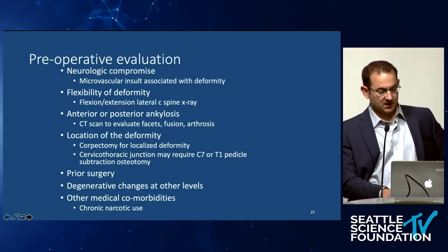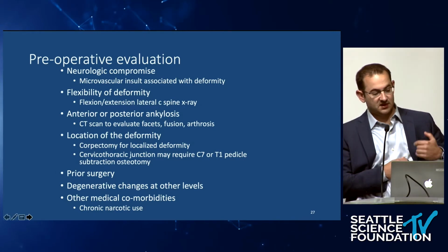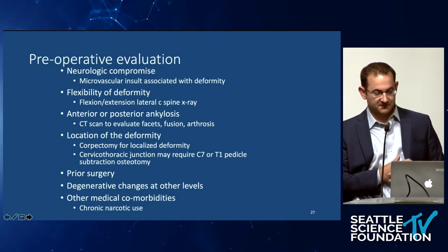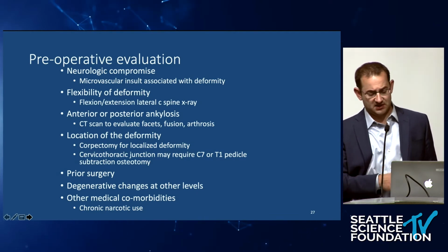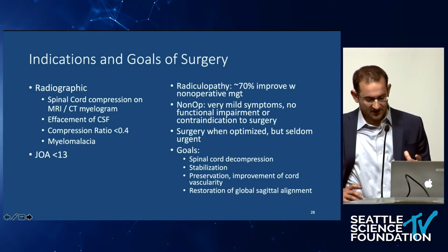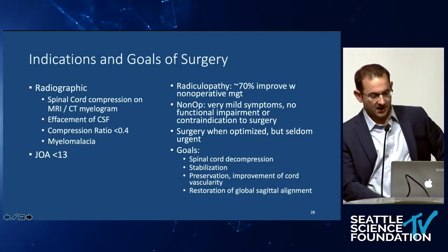Obviously, when we're evaluating these patients, you're going to look at all these different factors to assess your approach. If the patient is not an appropriate candidate for corpectomy, I'm not going to do a corpectomy. It's not necessarily my default approach. Otherwise, I'll show you a case of more or less ACDFs that were done and wedged to open a deformity.